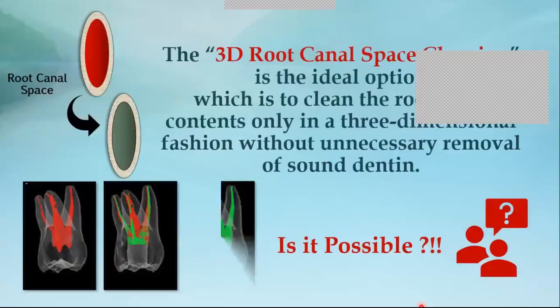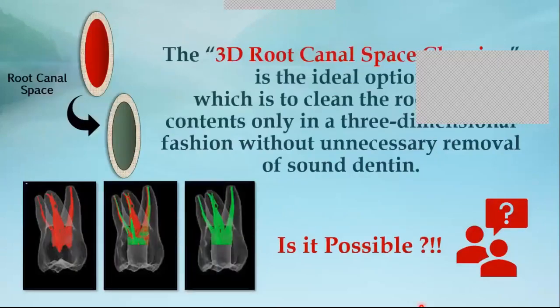Three-dimensional root canal space cleaning is what every clinician strives for, and is considered the ideal option, which is to clean the root canal content only in a three-dimensional fashion, without unnecessary removal of sound, healthy dentin. Is it possible?